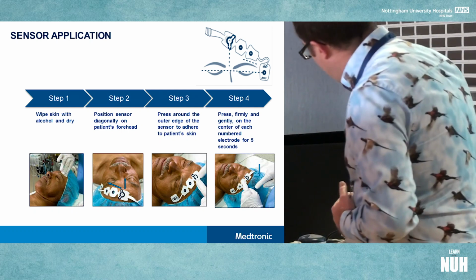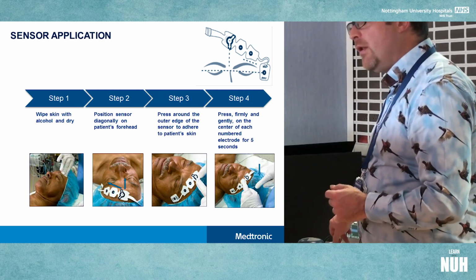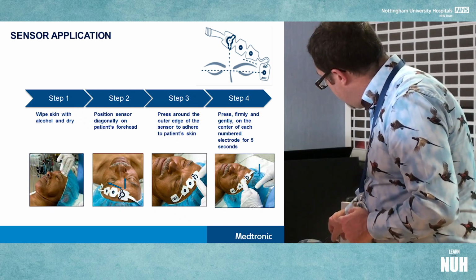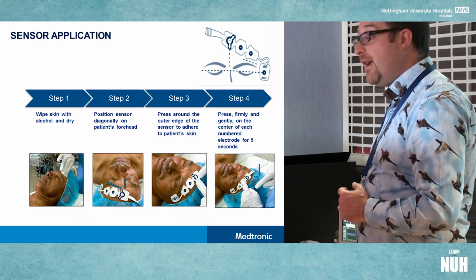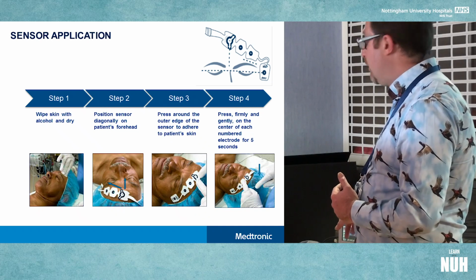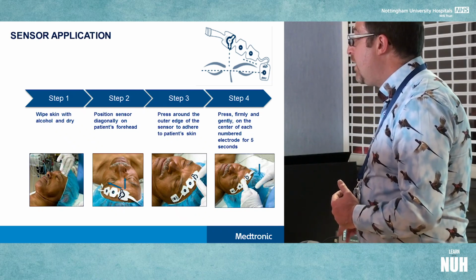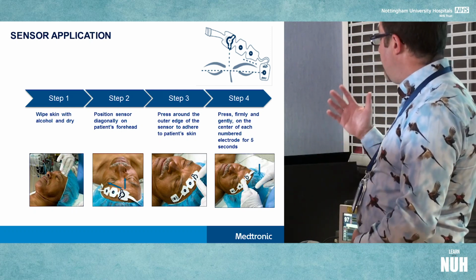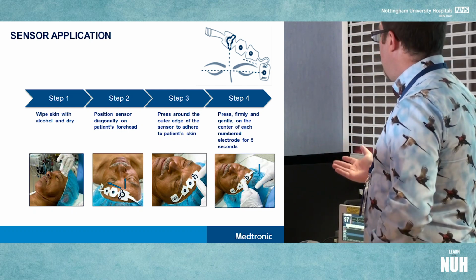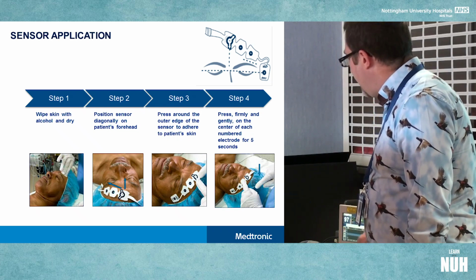Okay, so we're going to do a little experiment in just a second. So from our EEG, we've got the BIS number on the left, the signal quality, which is the green bars here, and if we've got more than 2 green bars, we'll have a BIS number that can be read. The immediate EMG here, which we see is the orange bars because he's awake, he's alert, he's got a strong forehead frown response, and then the BIS trend over time.